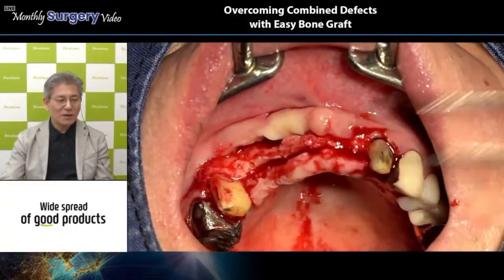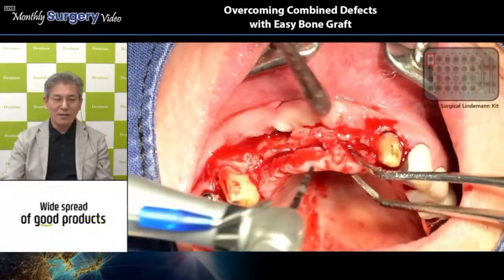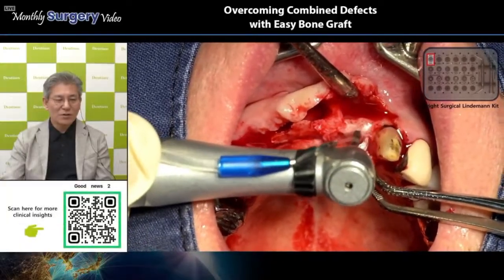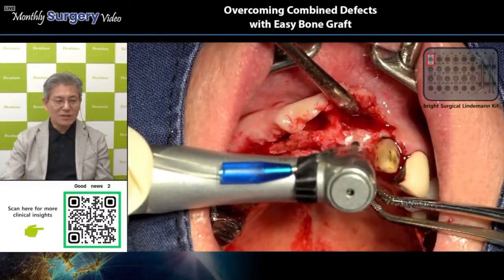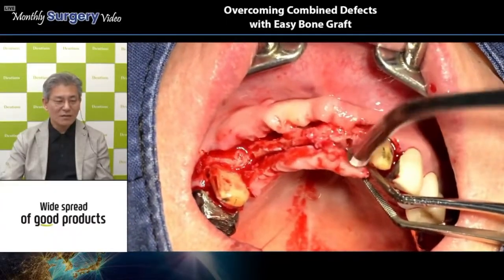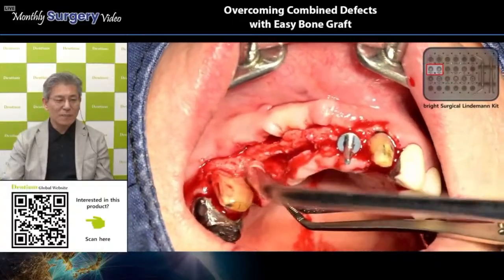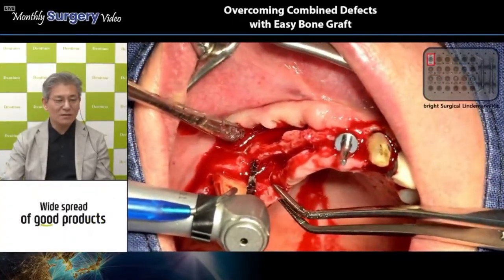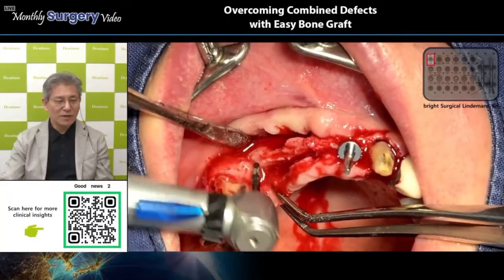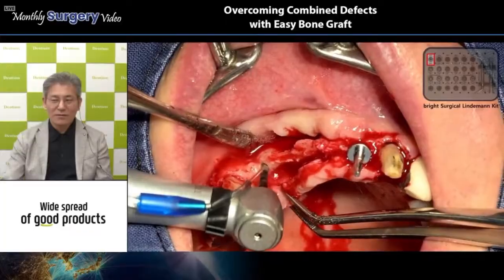What to think about this high-speed bar usage? Sometimes we use this style of small round bar to make an indentation. In the narrow ridge case, the cortical plate at the top portion is actually thick. So instead of this procedure, if you just use the initial drill, like a Lindemann drill, first on this area, the top cortical plate makes it slippery during the drilling. So to prevent this kind of discomfort, Dr. Chung used the high-speed bar first, and then the Lindemann drill to make the proper osteotomy with proper depth. I think almost 11 millimeters.